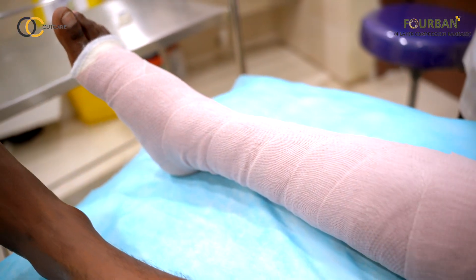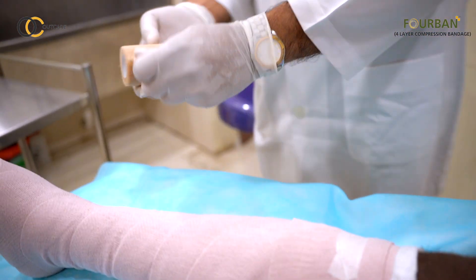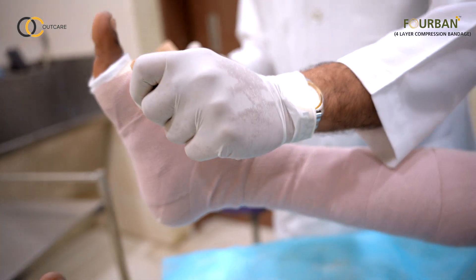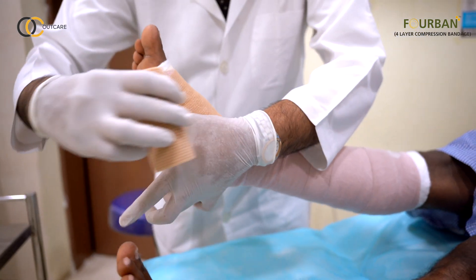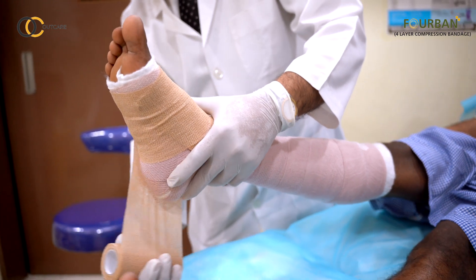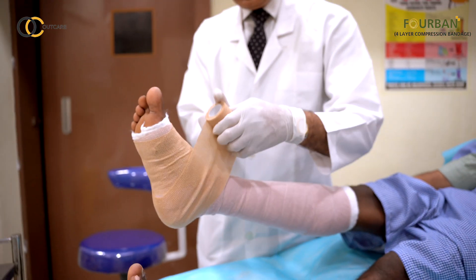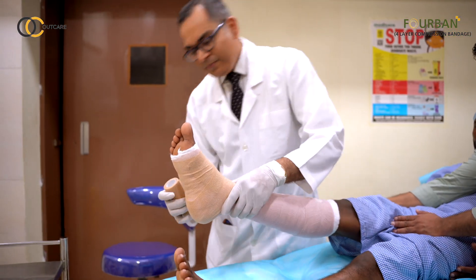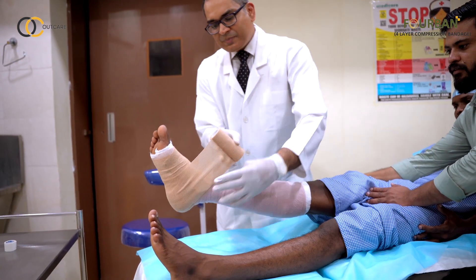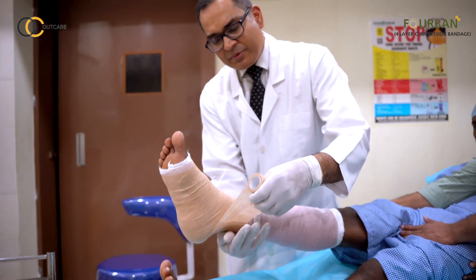Now we go to the last layer of the 4-layer bandage, which is the cohesive bandage. We once again start at the base of the toes and go in a spiral fashion. At the level of the ankle, go in a figure-of-8 fashion over the heel, and then above the ankle continue in a spiral fashion with 50% overlap.